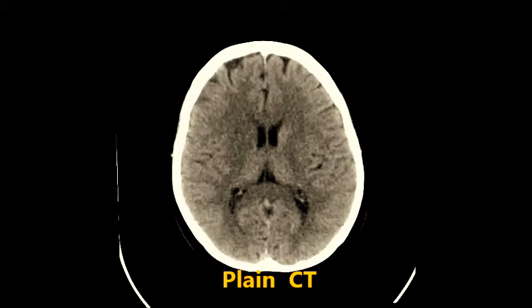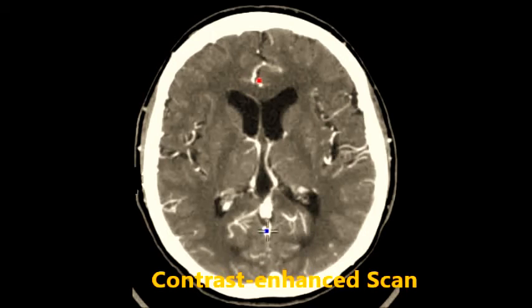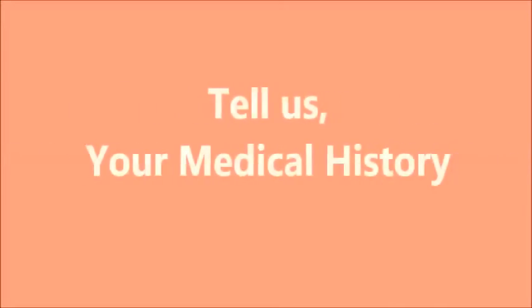Plain CT is a scan that does not require any injection of contrast media and takes a shorter time to finish the scan. Contrast enhanced CT is a scan that requires injection of contrast media and will take a longer time to finish the scan.